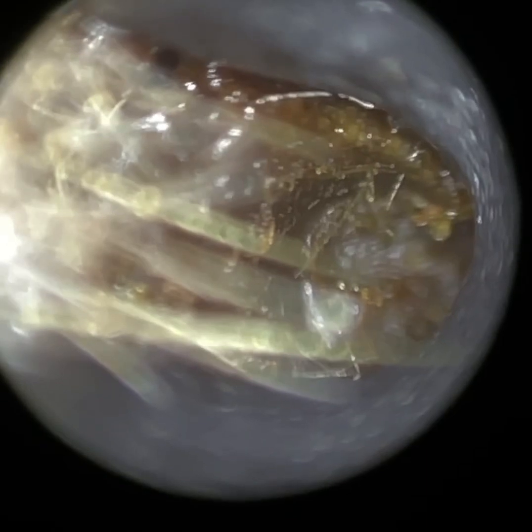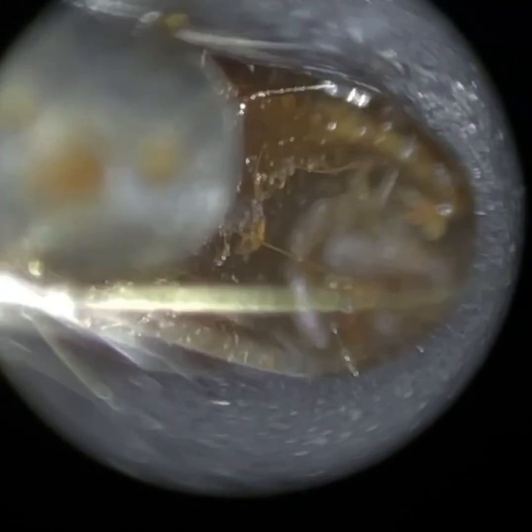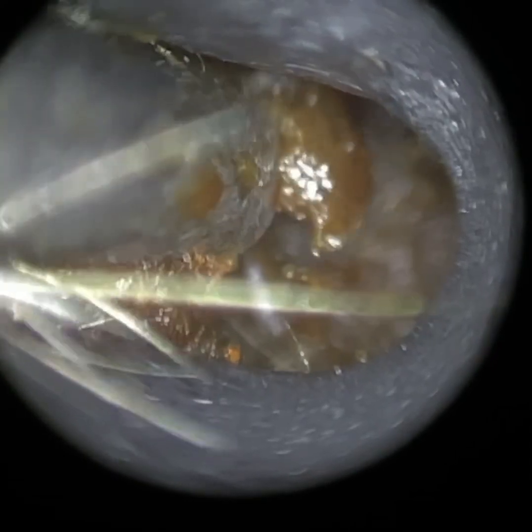I've reverted now to the smaller speculum — this is our 3.5mm speculum. And even with that, you can just see how clear the view is. We've been able to dilate the ear and open it up much more.